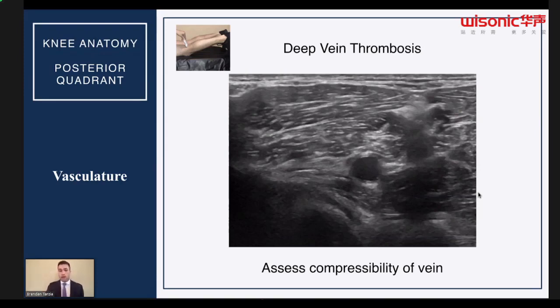All the time, I also put on pulse wave or do M mode of the ultrasound if I have any questions about whether it is vein versus artery. If a person is severely dehydrated or volume down, then a lot of times it's actually pretty difficult to know if it is the vein or if it is the artery.